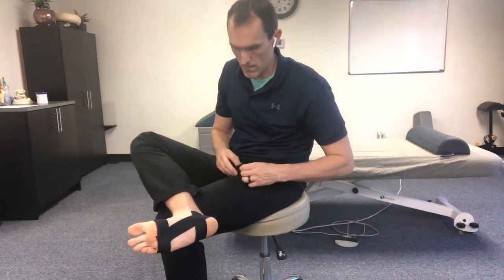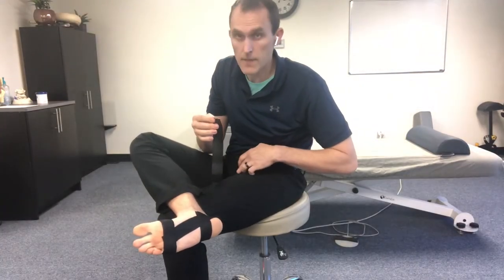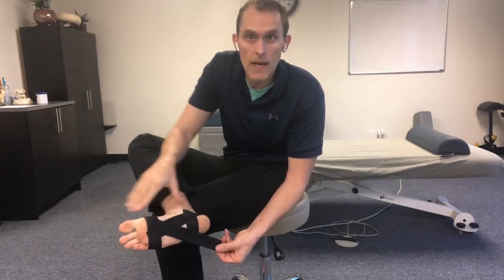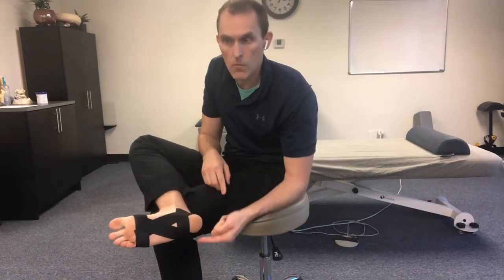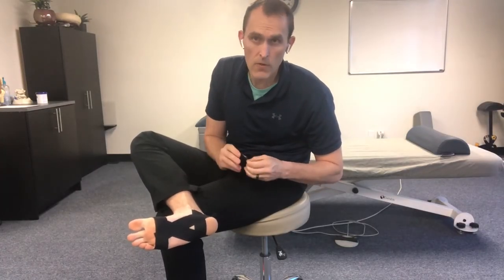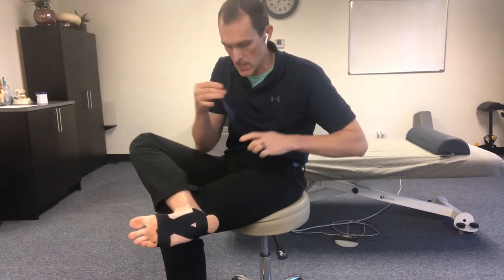Now we're going to do the reverse — one piece on this side and then wrap it around the other way. Just get a rough estimate of the tape length, tear it, then go from just under the knuckle, pull a little bit, and wrap around the backside again. So we did one going this way and now one going that way. See if the loose parts lay down as best you can, but don't put too much pressure since we'll catch it on the next pieces. We've now got an X in the middle. We can reinforce those — I'm going to do one more in each direction to get a little more support.